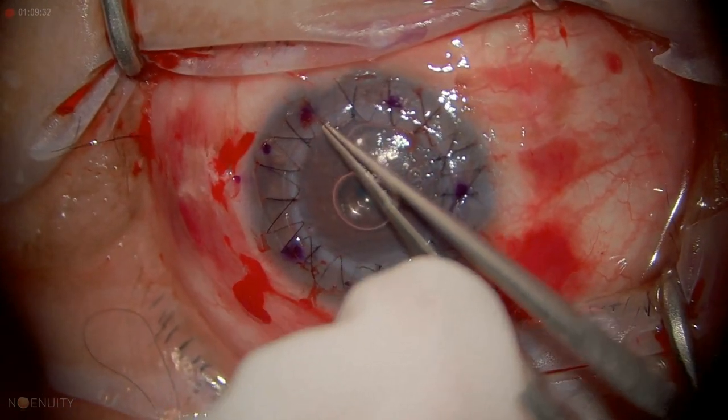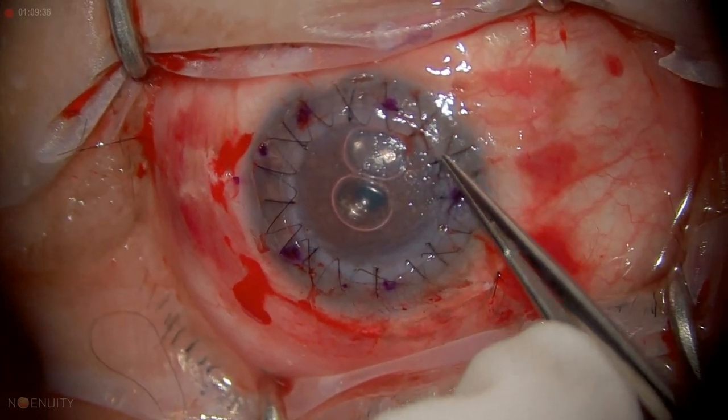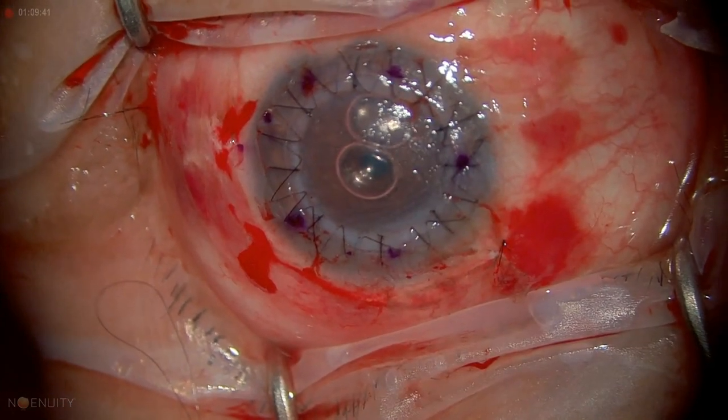She has a bubble in the AC — just leave that. That's going to help with Descemet's here, but she doesn't have to position tonight. We're all done — got a nice graft there. It should be good.